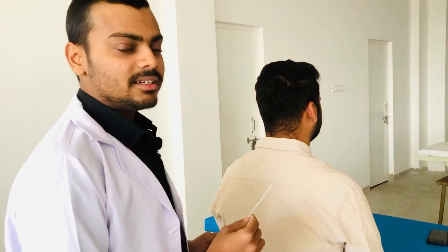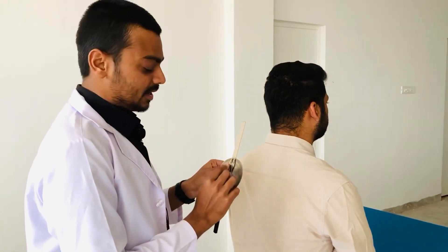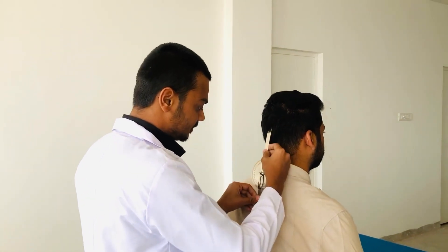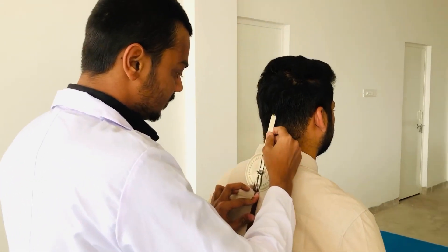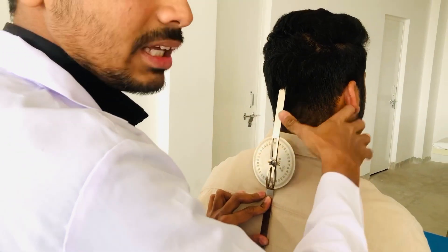For measuring the neck lateral flexion, we have to put this axis — or you can say fulcrum — on the C7 cervical spine like this, and then you have to hold it and do the lateral flexion.